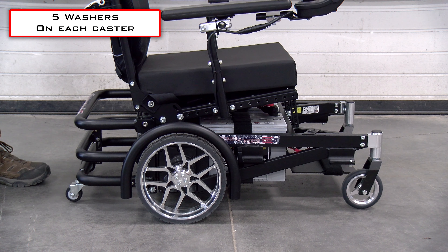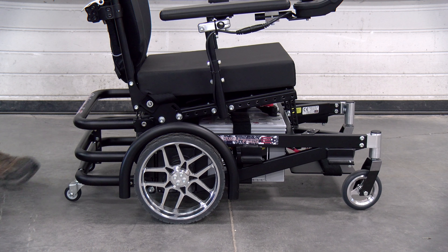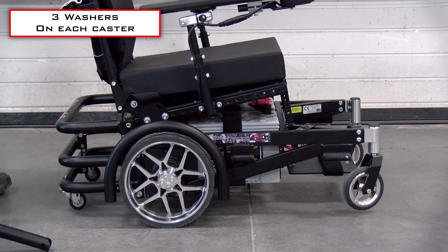This looks much better. The difference isn't huge, but really it all comes down to personal preference. We'll switch back to the first video so you can really see and compare them side by side.